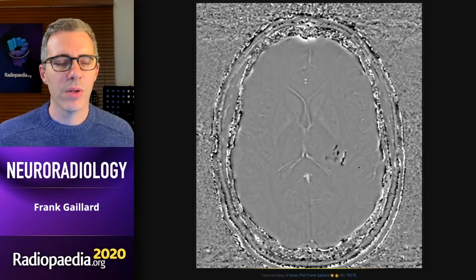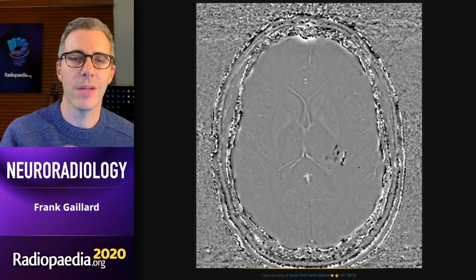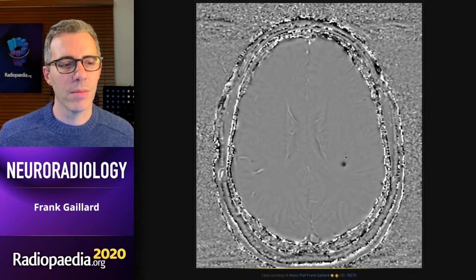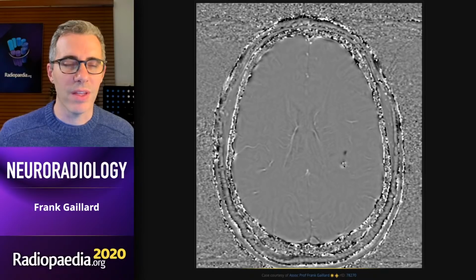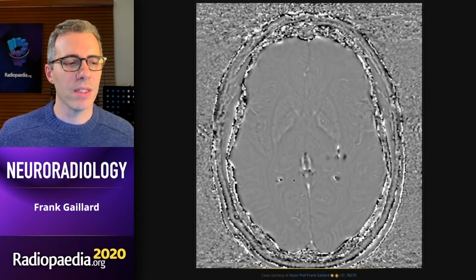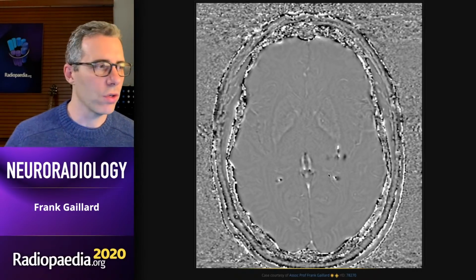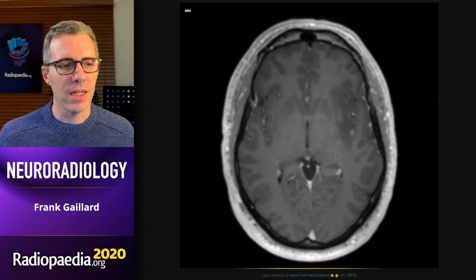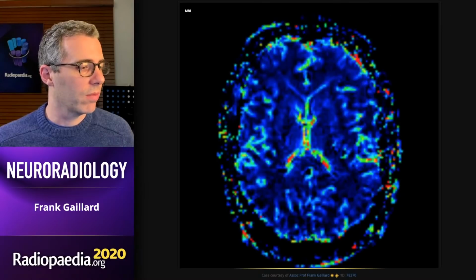It's not always possible to distinguish whether it's a splodge that should be white with black areas or a splodge that should be black with white areas. But generally you will see that a dominant pattern emerges. Here it's black with a center of white, black, mostly black. So this all looks very similar to what you know is calcium, and this would fit with calcification. And in this setting, you've got a diffuse tumor with some prominent maybe vessels, but no solid contrast enhancing component, with calcification. That's very likely to represent an oligodendroglioma.